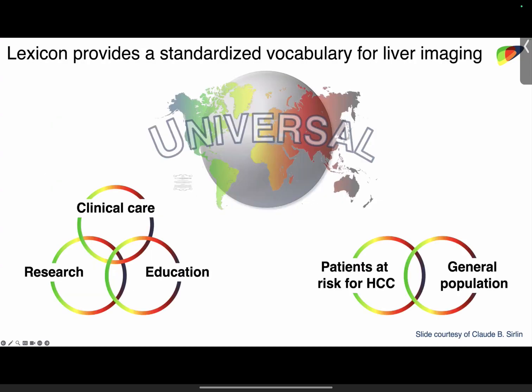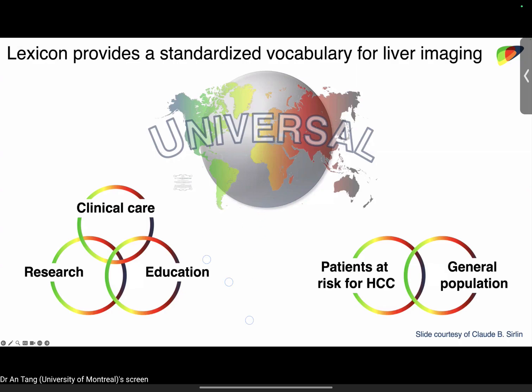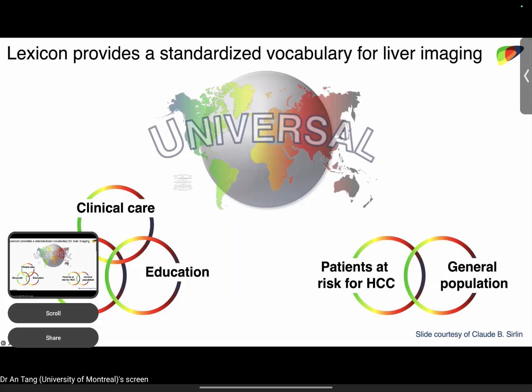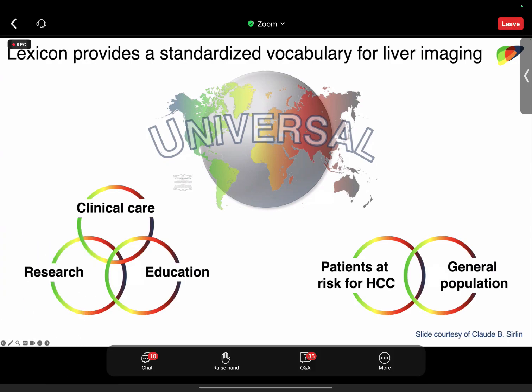So the long-term vision of the LI-RADS lexicon is to provide a standardized vocabulary for liver imaging in 3 settings: education, research, and most importantly, in clinical care. And over time, we've also expanded the context of use of the lexicon from a narrower context of patients who are at risk for HCC to liver imaging in the general population.